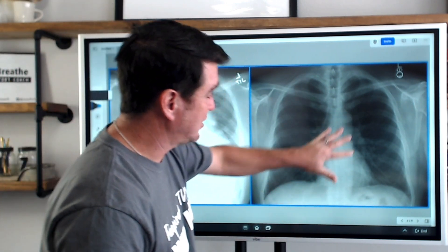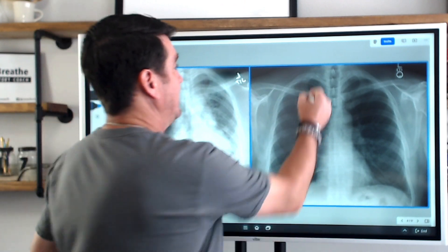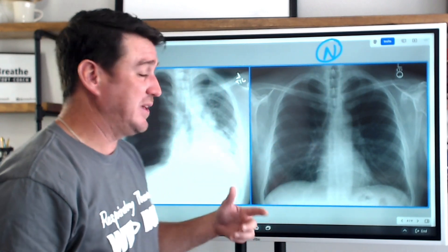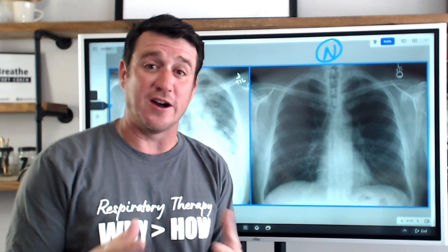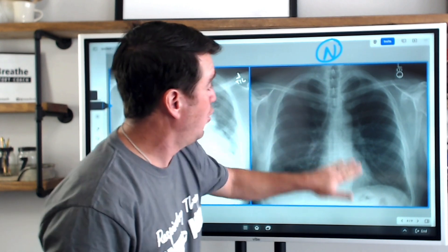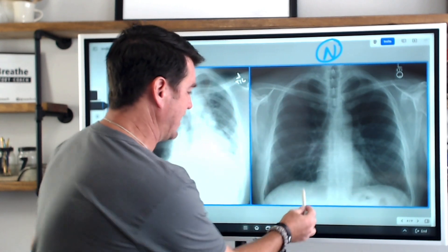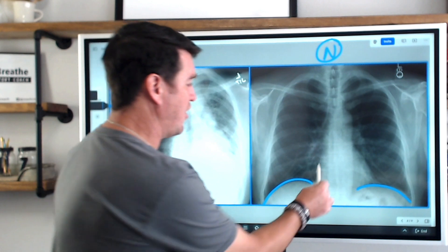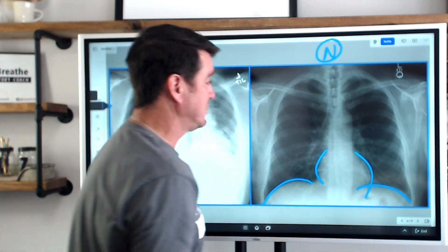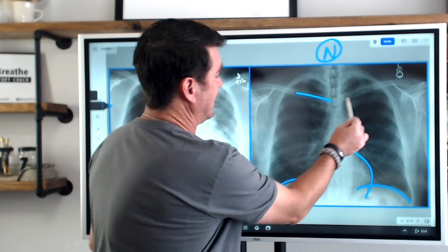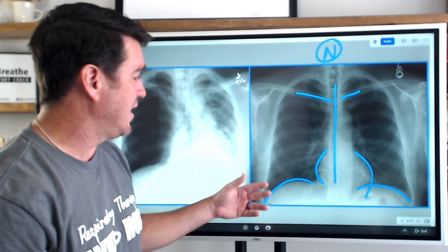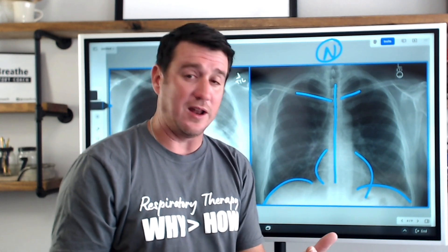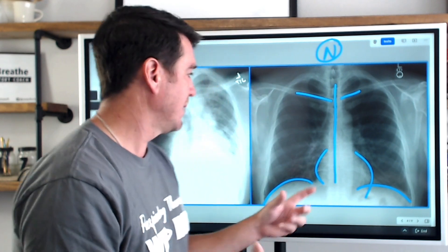Right off the bat, this x-ray on your right is the normal chest x-ray. We know it's normal because we see that it is well aerated — there is good aeration throughout both lung fields. We've got good costophrenic angles representing the diaphragms, a heart that does not appear to be enlarged, clavicles, and everything meets at the spinal column. This is a good quality, normal chest x-ray.